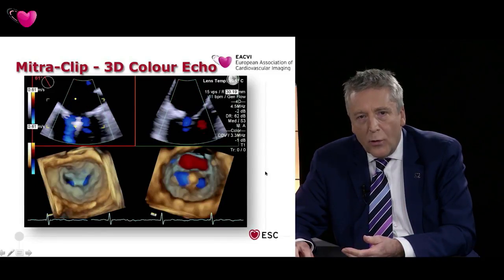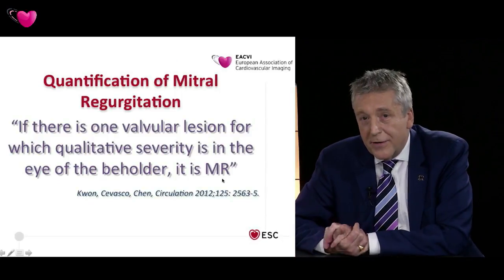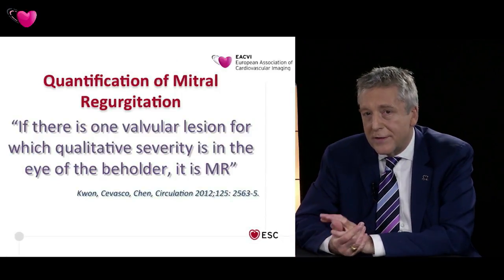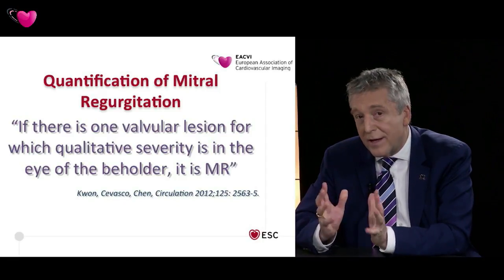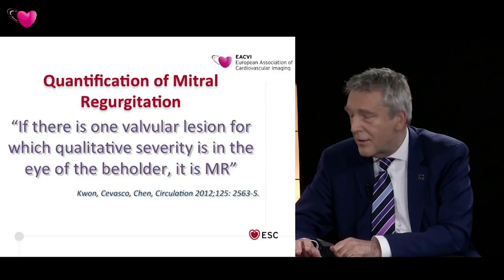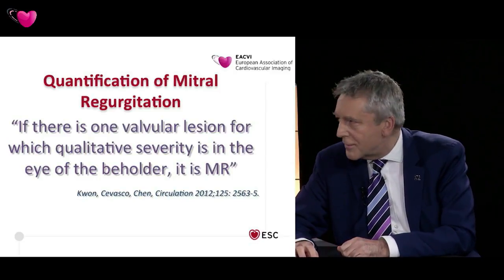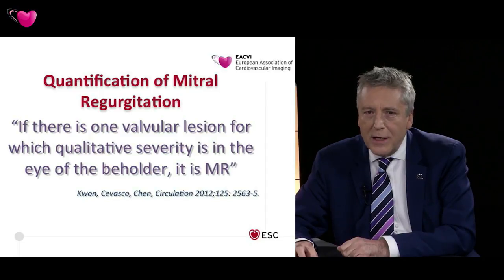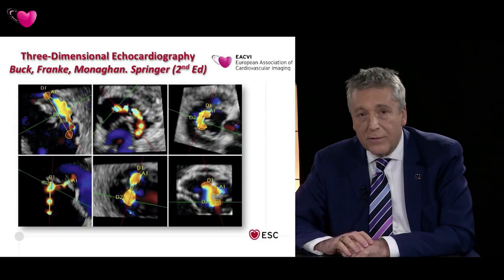And I think it's important because I really like this quote from Circulation, which said, if there's one valvular lesion for which qualitative severity is in the eye of the beholder, it's mitral regurgitation. And I think more than any other valve, this is the one where we look at it and we just hold a thumb up in the air and say, yes, it's severe or it's moderate, and we don't make the measurements that we ought to, and that's very important, particularly in this percutaneous arena.